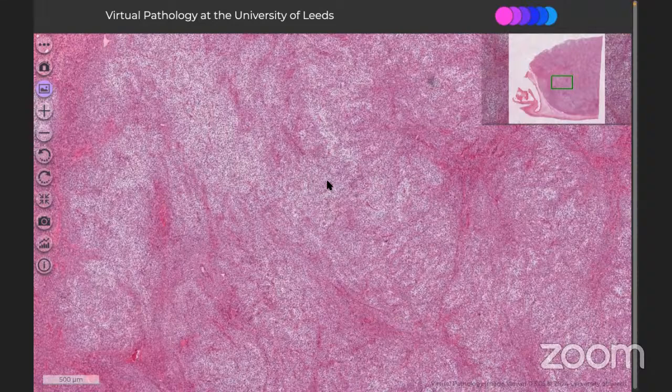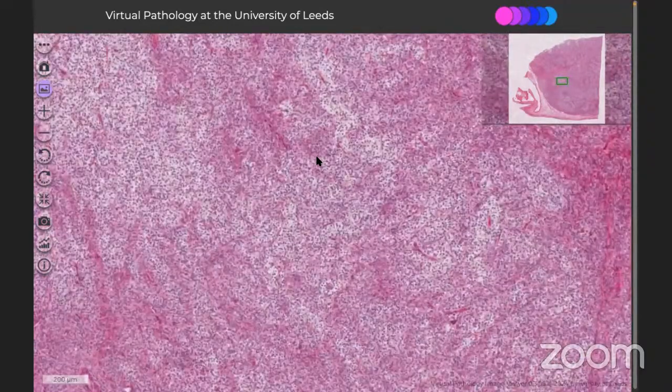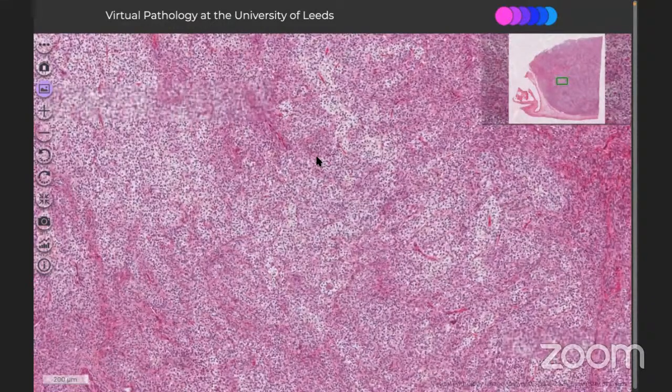And in one point you can say in the further workup that you will do further sectioning just to exclude any minor component of adult granulosa cell tumor. If it is present, then you can say thecoma with minor component of granulosa cell tumor. If it is more than that, then it is a mixed tumor. So this is how you can classify after further sectioning.